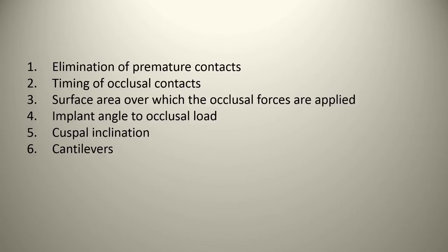And just like in physics anywhere else, this is the same physics that's going to apply for dental implants. Number seven, the implant crown contour. So obviously the wider the implant, the more surface area, the wider the implant crown, the more surface area is going to be for occlusion as compared to just putting a smaller crown surface for the patient. Lastly, we talk about things like crown height.